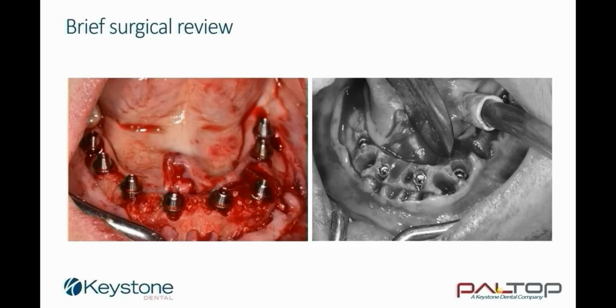On completion of the placement of the implants, the straight multi-units were connected. The ideal cuff heights of the multi-unit abutments were chosen during the computer-guided planning stage. The bone harvested from the reduction of the anterior portion of the ridge could be used to fill the socket areas. The completion of the suturing of the soft tissues and the luting of the temporary bridge was a quick and efficient process.